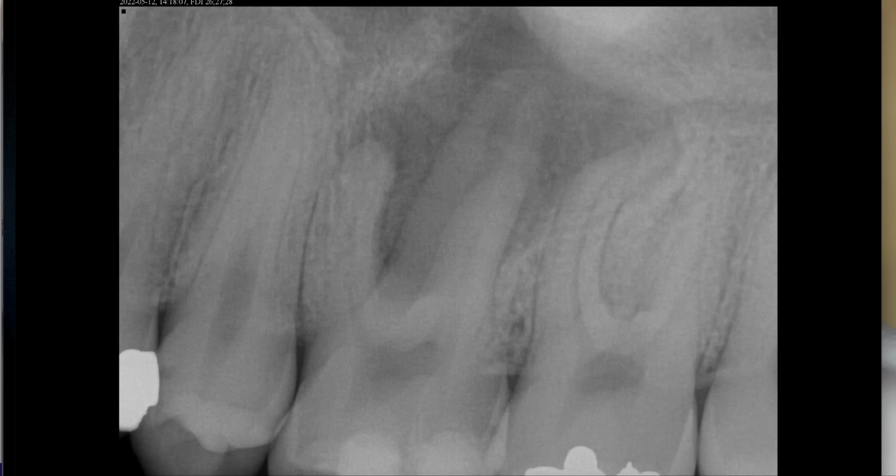The first thing I'm going to look at in this case is, why is this tooth necrotic? This patient is a high caries risk, and we've placed him on the high caries risk protocol. It kind of looked like, is this tooth cracked? Why has it been necrotic for a long time? I think what happened was either we had leakage, since she's got a number of leaking restorations on the opposing side, or I'm wondering if the distal pulp horn was nicked when he was a little kid with this restoration here, which is very close to this pulp horn, or it just leaked over time. After systematic probing depths and whatnot, we deemed it still good to go.